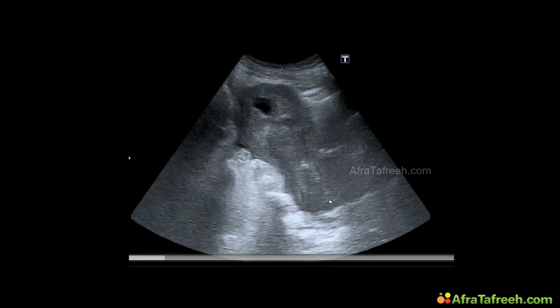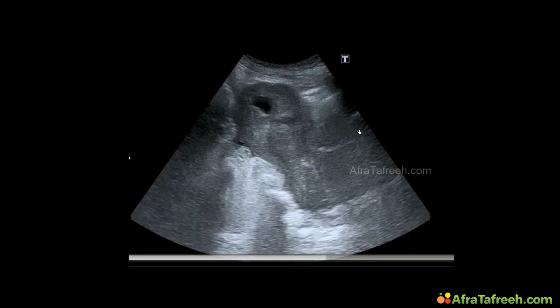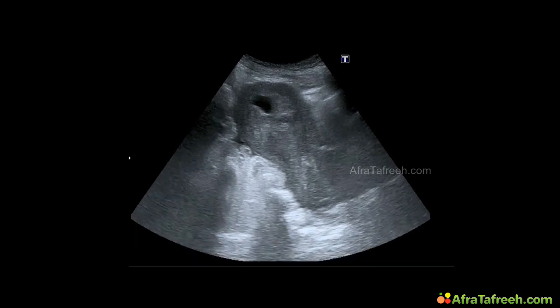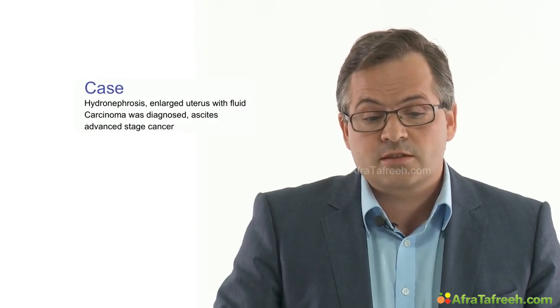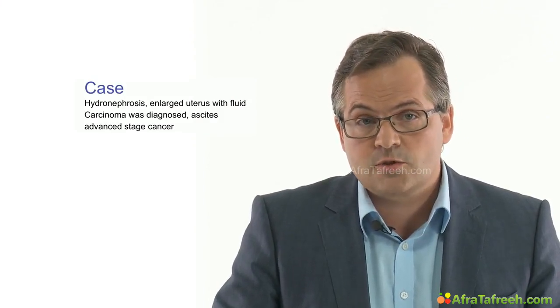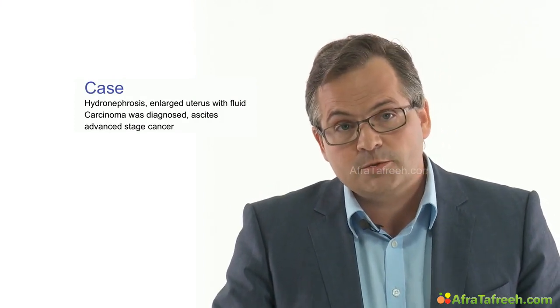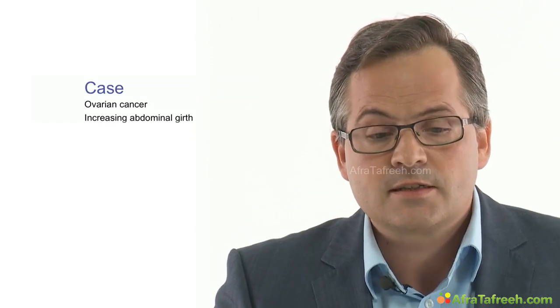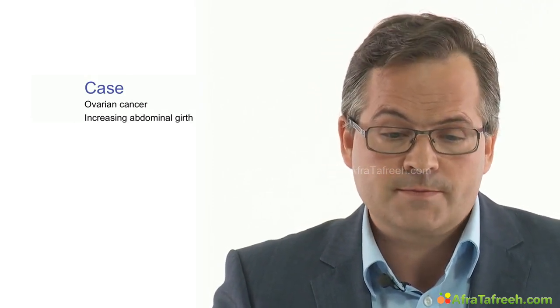And in the following scan, in the longitudinal scan, we see that the tissue in the region of the cervix is thickened and is also inhomogeneous. And in this case, it was an advanced stage cancer of a cervix carcinoma with hydronephrosis and free fluid in the abdomen and fluid in the cavity. In the next case, ovarian cancer was already known, but there was the report of an increased abdominal girth.